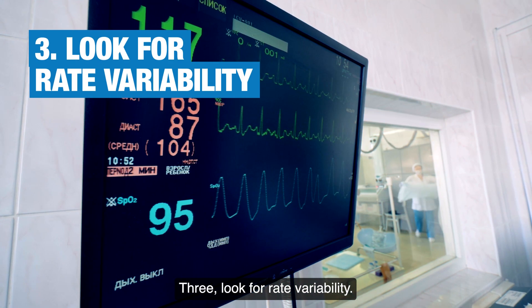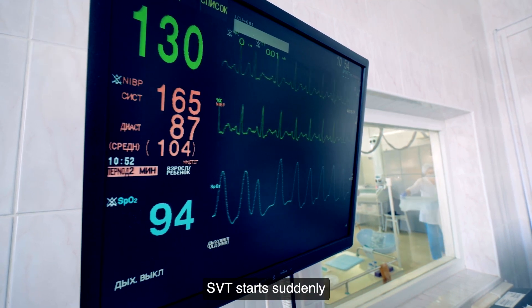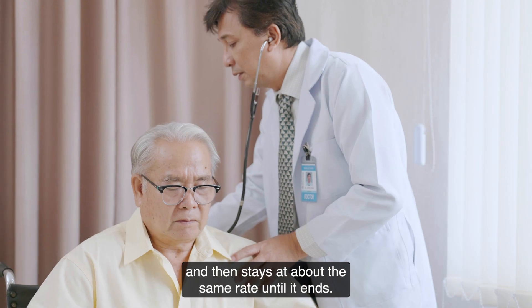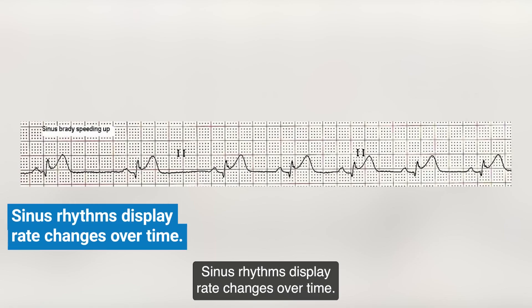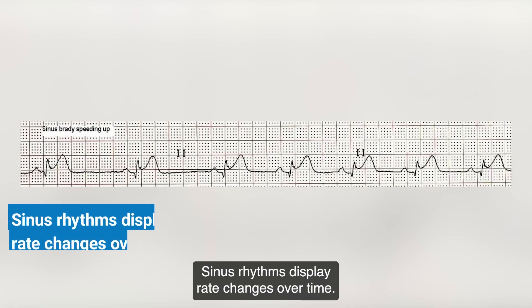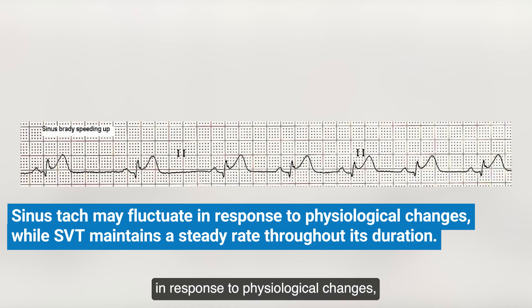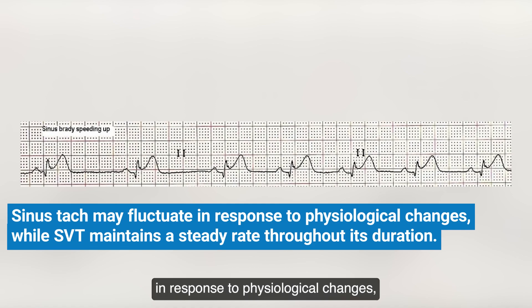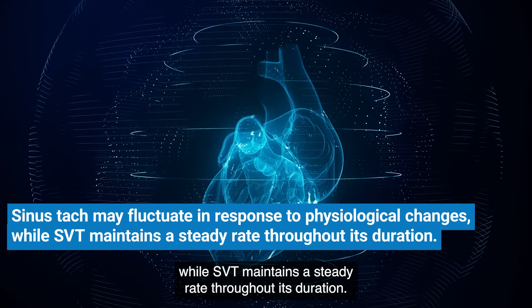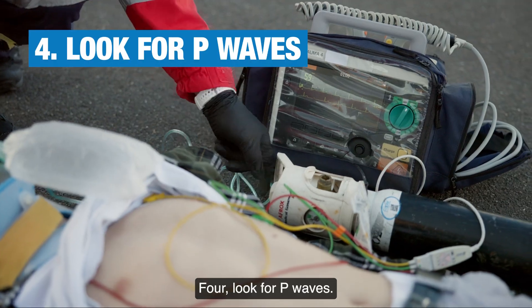Tip 3: Look for rate variability. SVT starts suddenly and then stays at about the same rate until it ends. Sinus rhythms display rate changes over time — sinus tach may fluctuate in response to physiological changes, while SVT maintains a steady rate throughout its duration.